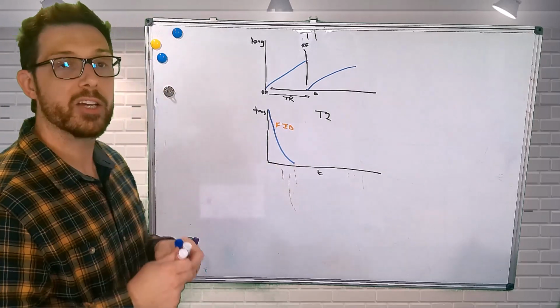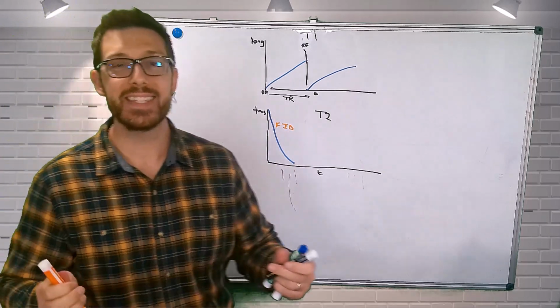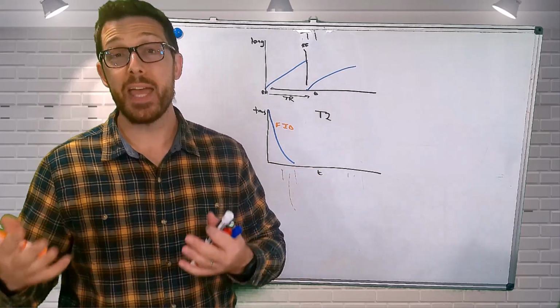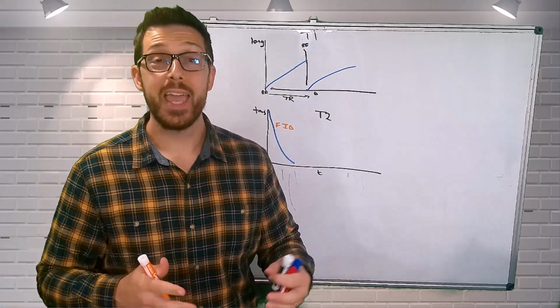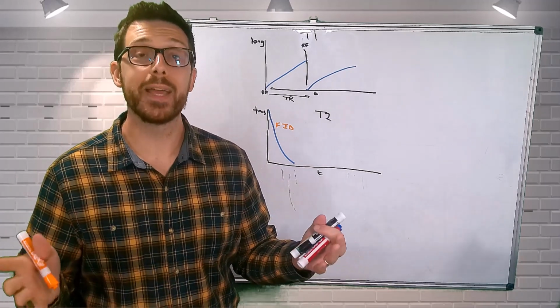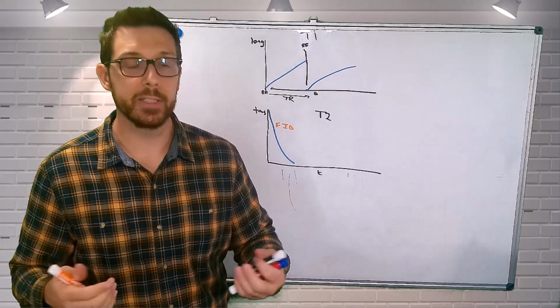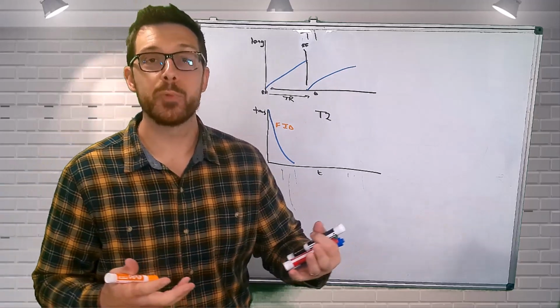So we get this free induction decay in our image. And free induction decay is essentially this decay of transverse magnetization that is dependent on neighboring protons and the uniformity, or homogeneity, of our magnetic field at isocenter. So how uniform is this magnetic field, and where are those neighboring protons in relation to each other?